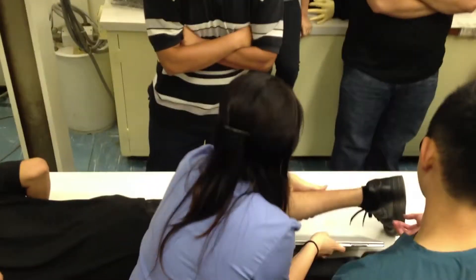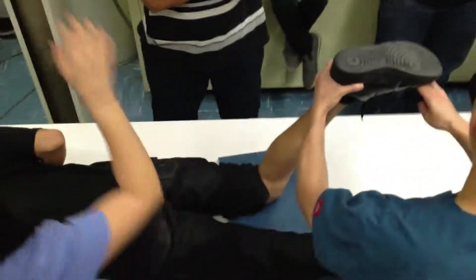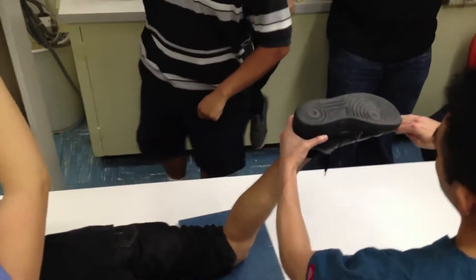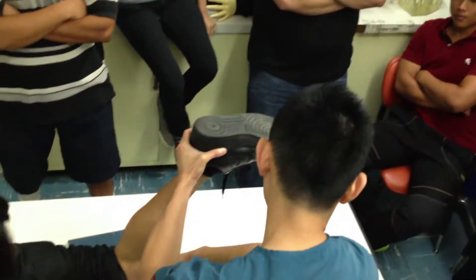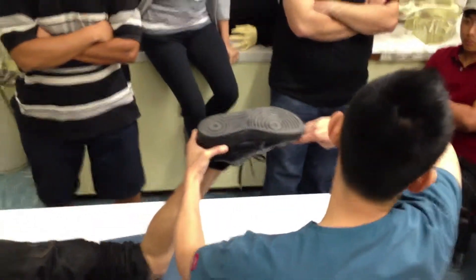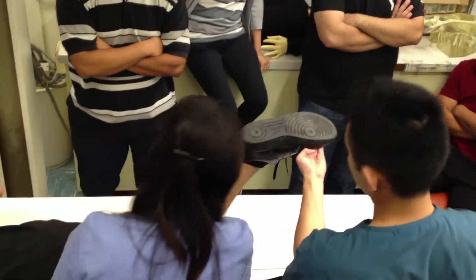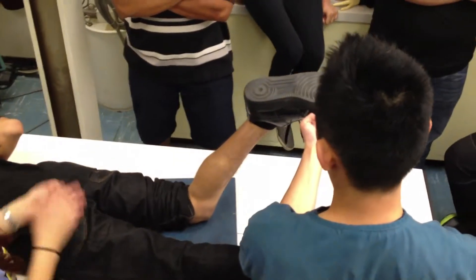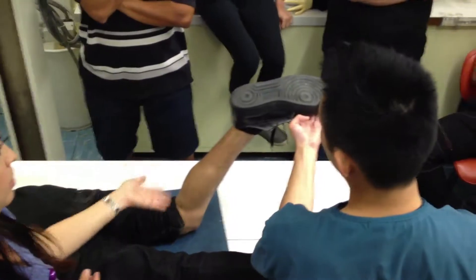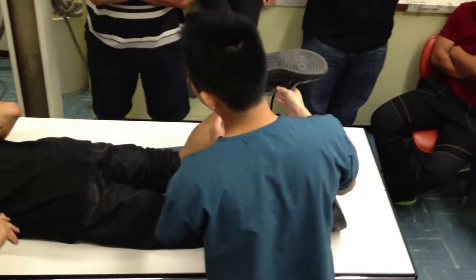It's pretty much the same thing but you're doing it from a PA. This is a little bit more tricky because you need to get the foot out of the way. Just pretend your tube is positioned going from down here instead of from the top. You're placing the tube, bringing it down underneath, turning the angle, and it's coming in through here. Your collimation is a little bit stopped. This is similar to another way to do the intercondylar fossa view too.